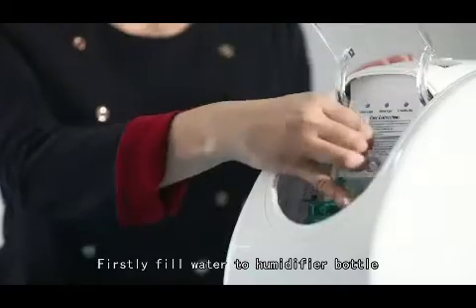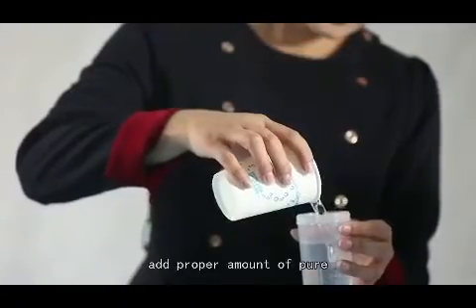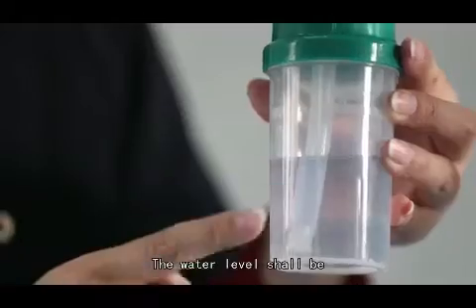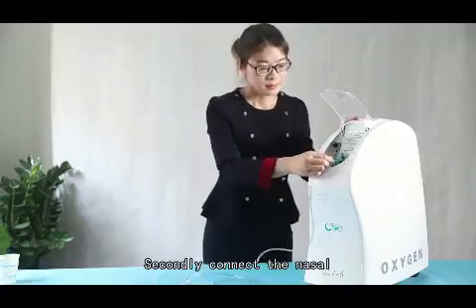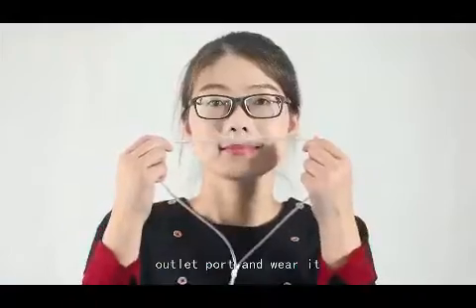Firstly, fill water into the humidifier bottle. Take off the bottle. Add a proper amount of pure water to the bottle. The water level shall be between the maximum and minimum water lines. Secondly, connect the nasal cannula to the oxygen outlet port and wear it.